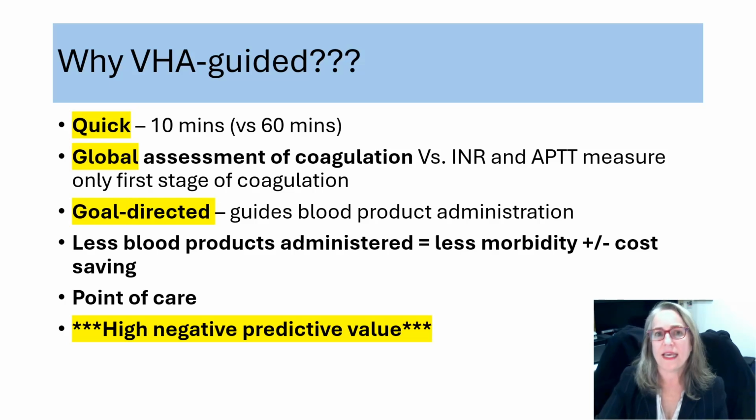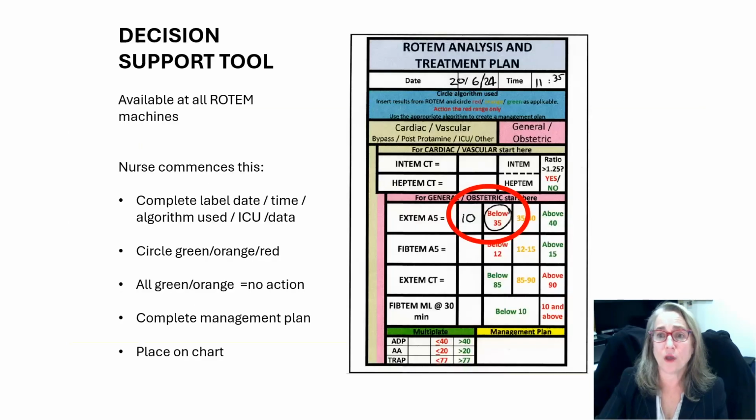In order to get this translated easily across all staff, including our nursing staff and other staff that may be bringing the test or the printout to you if it's situated between the two theatres, we established a decision support tool locally at Randwick campus. And so it looks like this, and I actually sent some of these, so hopefully some of you have printed these out so that you can use them when you do the examples at the end.